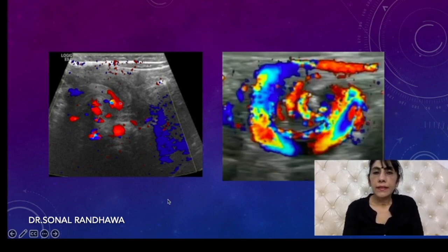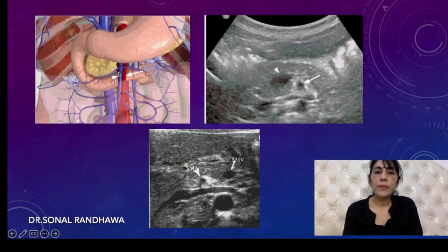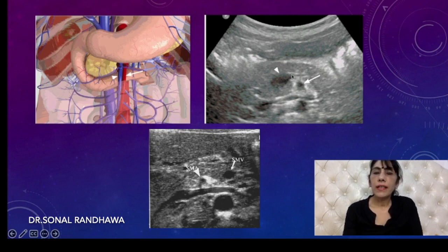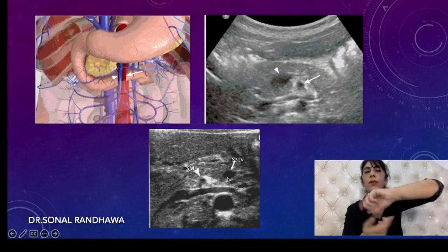The second differentiating feature is reversal of the positions of the superior mesenteric artery and superior mesenteric vein. Because of the clockwise twisting, the superior mesenteric vein wraps around and the positions change. Normally, the superior mesenteric artery is on the left and the superior mesenteric vein is on the right. In volvulus, SMA comes towards the right and SMV comes towards the left.